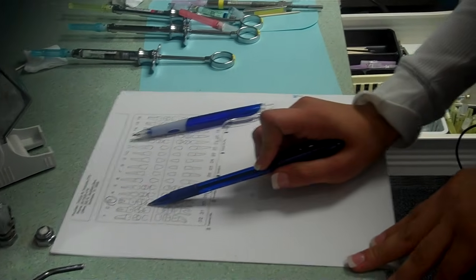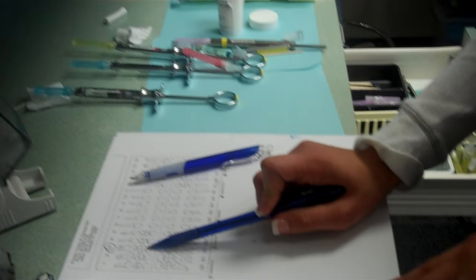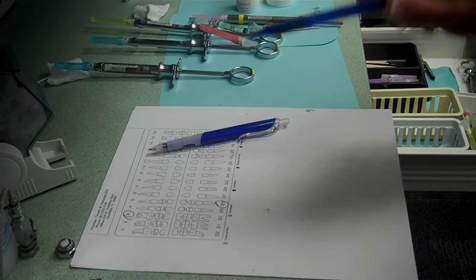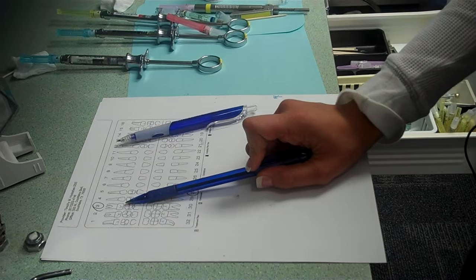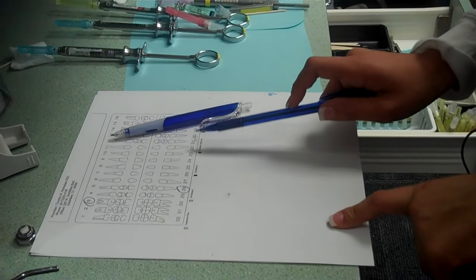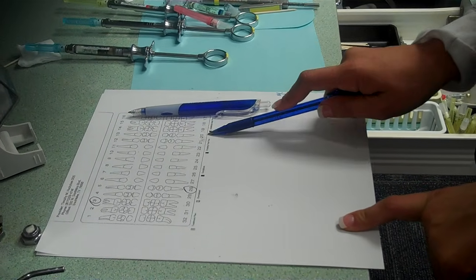Okay, and this one, it would need to be blocked, correct? No. On the molars? It's an upper molar. It's an upper molar, okay. Only blocks are on lower molars. This would be blue in the Septocaine, right? Yes, that's correct.